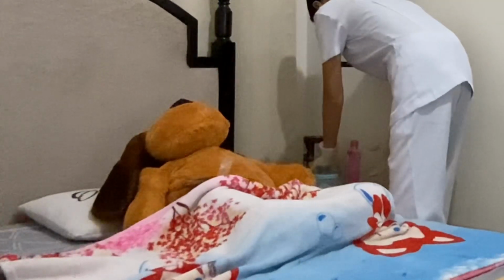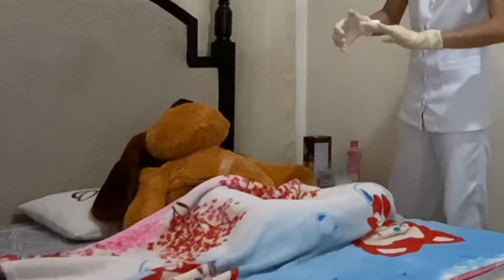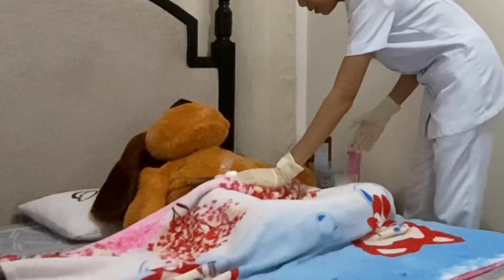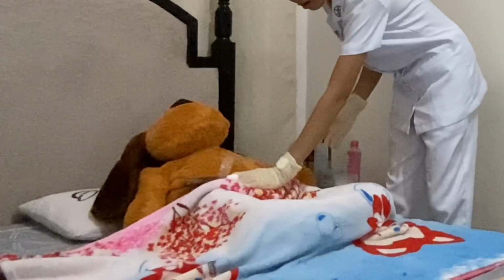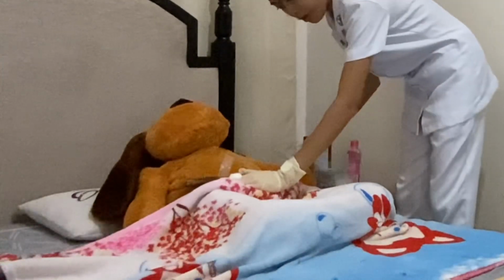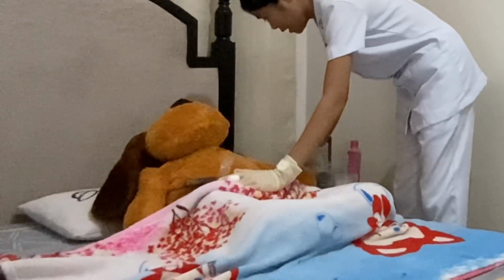And then after that, we're going to close this container filled with soaked cotton balls, and we're going to take out dry cotton balls and put them in between our third and fourth finger. And now we're going to prepare the injection site by stretching the site where we're going to administer the medication. We're going to slightly squeeze the area, and then we're going to uncap the syringe.